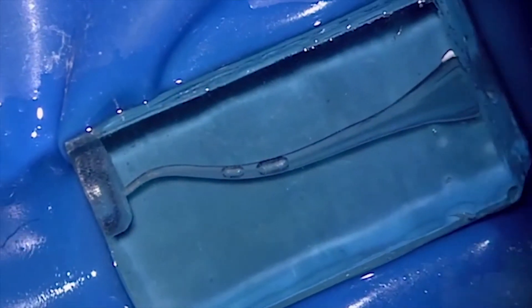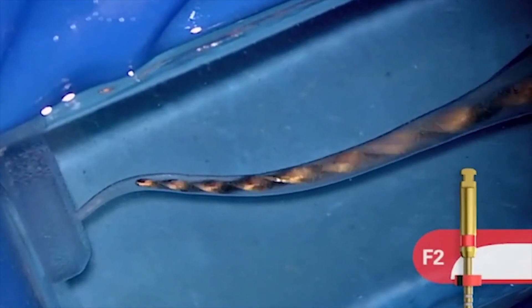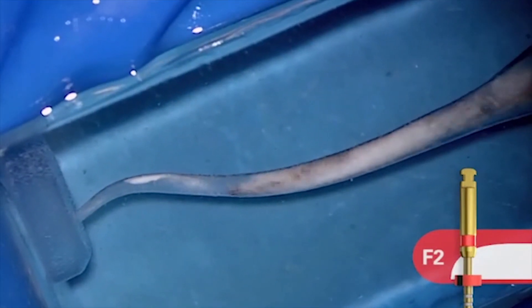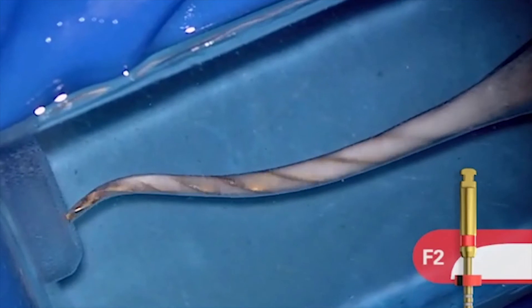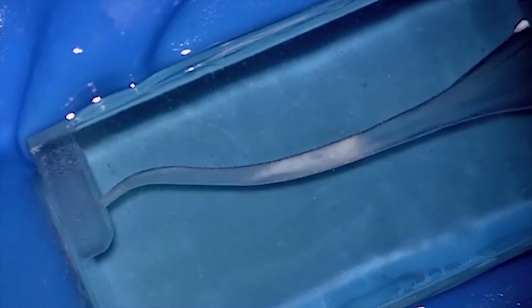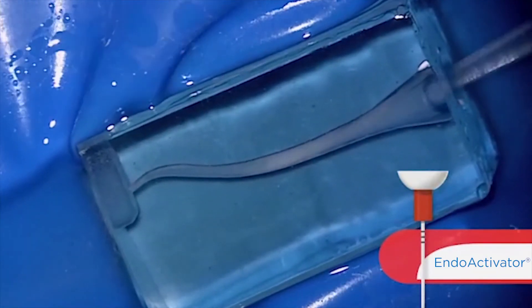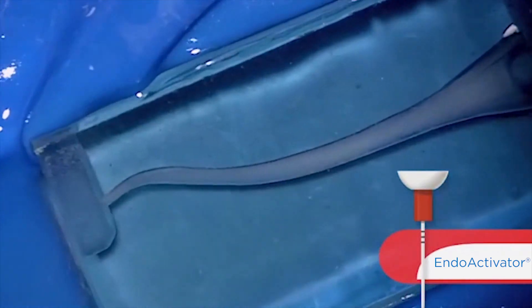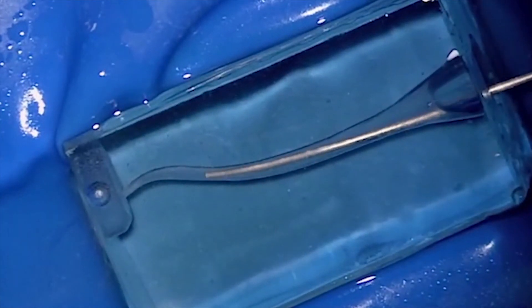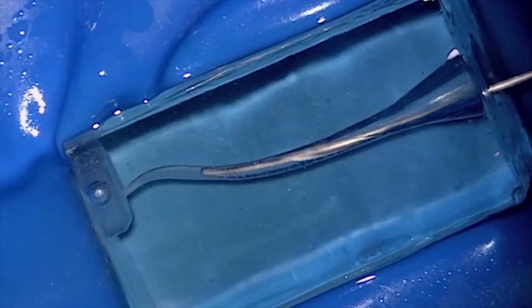Look at these files when they come out, especially the finishers, and see where they're cutting. We want to see debris on the more terminal blades of a file, which indicates that file just cut its shape in the apical one-third. It would be needless to continue going through a higher level of files and expanding the diameter if the file is loaded — if it's loaded, we've just cut its shape and it's done. Again, you can recapitulate this time with an EndoActivator, break up debris, move it into solution. Notice how clean the canal gets rapidly by just following the EndoActivator in and agitating the solution.